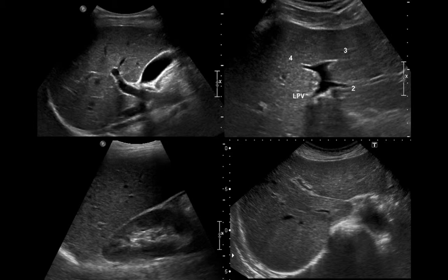When we scan the lower part, it is our kidney. The first part we talked about was the liver, and the second part we will talk about the kidney. You can see that when the liver echogenicity is identified as isoechoic, the kidney cortex should be darker, hypoechoic compared to the liver. And the central pelvis part should be brighter without internal black echogenicity. If there is that kind of structural disruption or change, that means some kind of problem.